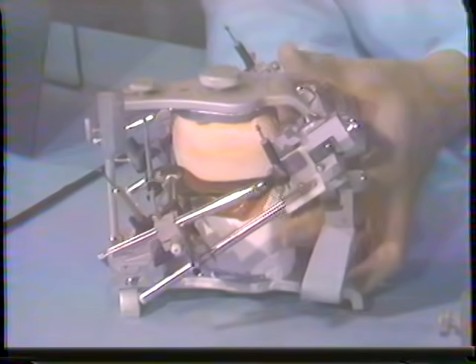For information, this can be put into the instrument. Then you go back and get a good centric relation record to mount the lower to this programmed instrument, which is a result of all these tracings made about the patient.